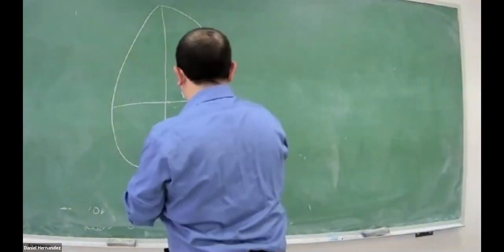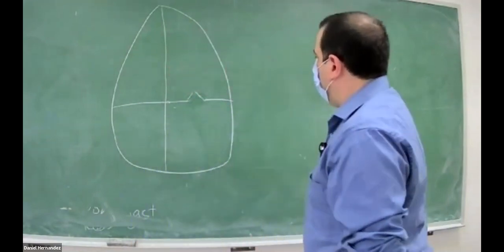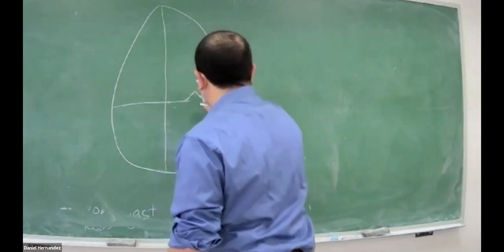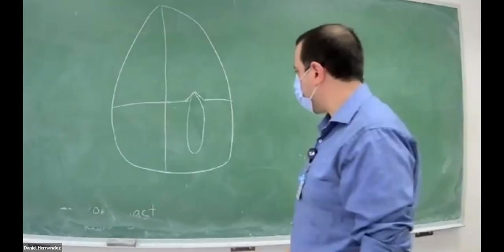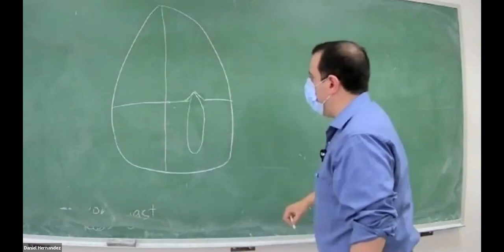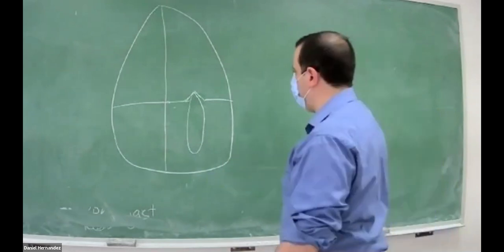I'll go a little bit into valves. So if we have mitral regurgitation, we have to understand what the heart's response is going to be to stenosis and regurgitation.